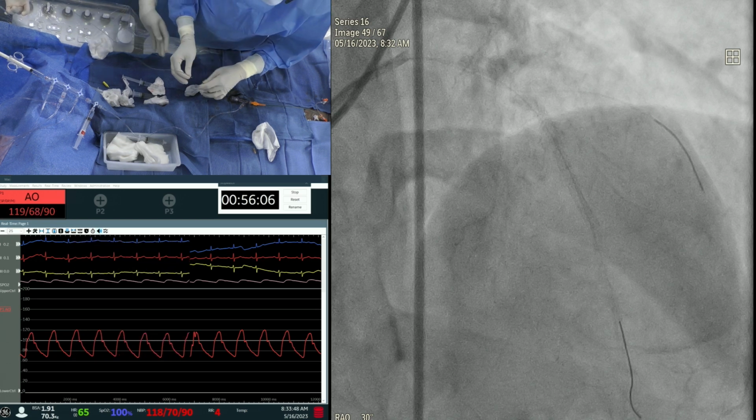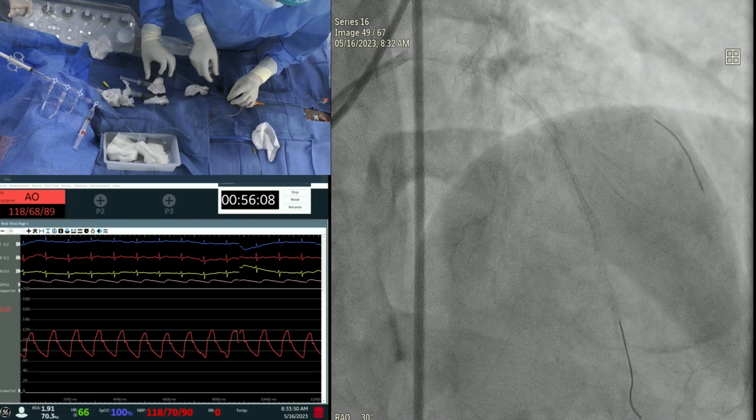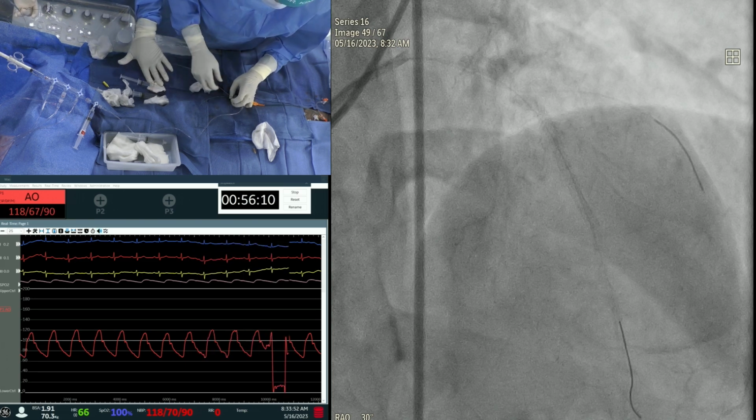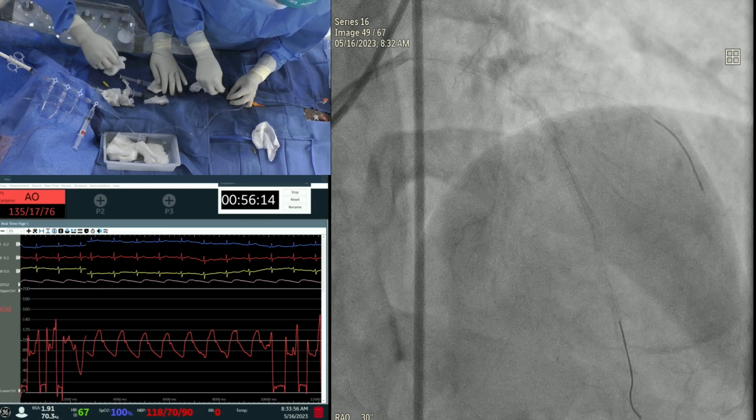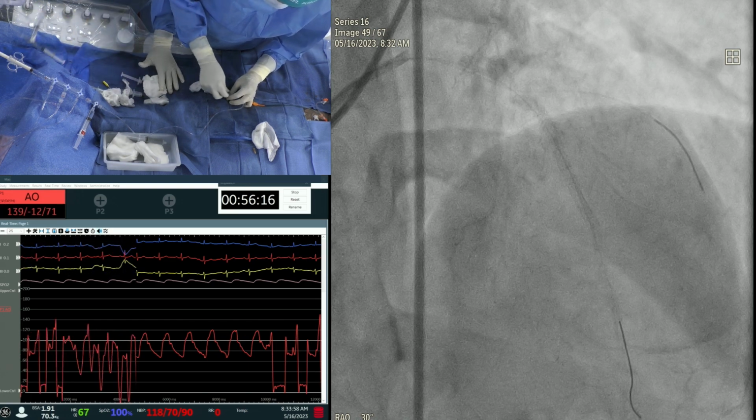Many years ago, you were doing a lot of SKS, which has now become different. Yeah, SKS, bye-bye. All right, let's go.